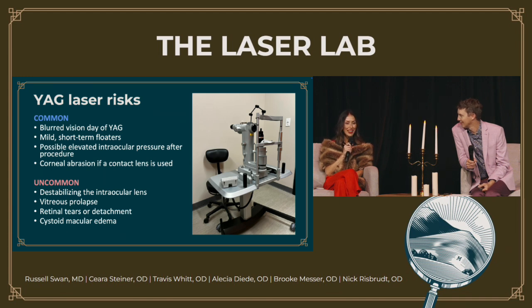things that we can do, but that we don't get to claim 0 risk on anything. And so, I tell them, as listed on here, today is going to be blurry because we've picked on you a lot with drops and scans, and by tomorrow you should already be functioning back to normal pretty well as long as the dilation's worn off. I warn them about floaters, that they'll likely see some floaters for a few days or a week after the procedure, not to worry about those, but that's just remnants of the capsule.